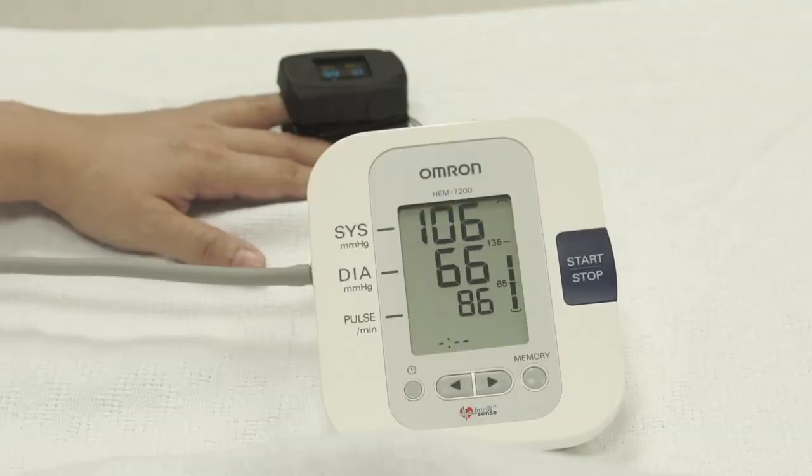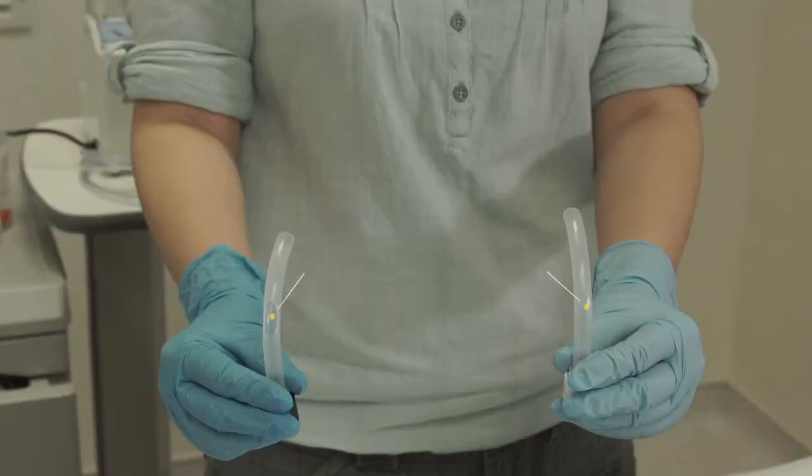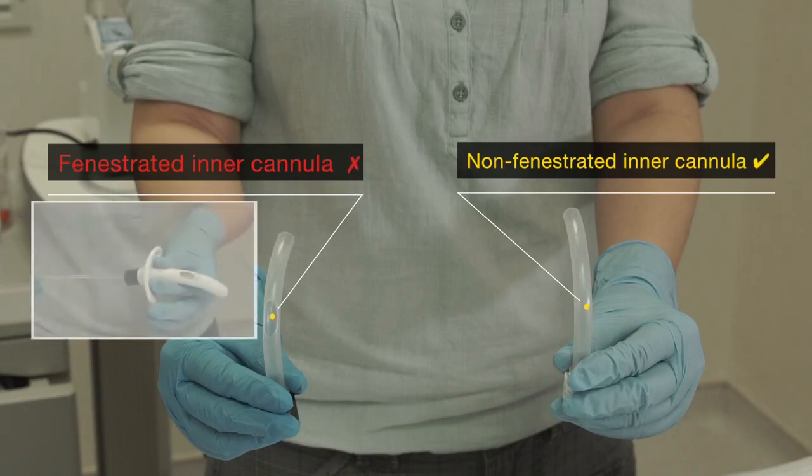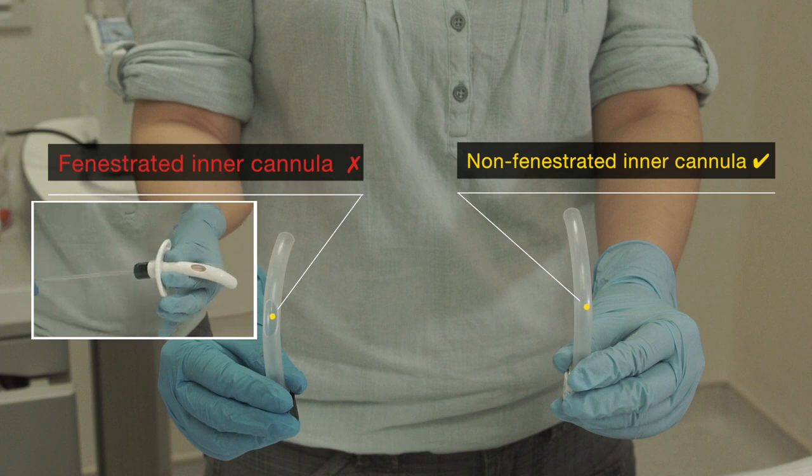Measure the patient's SpO2, heart rate, and blood pressure. Ensure that the non-fenestrated inner cannula is in place. Do not perform suction with a fenestrated inner cannula, as the suction catheter will go through the large fenestrated hole and injure the patient's windpipe.